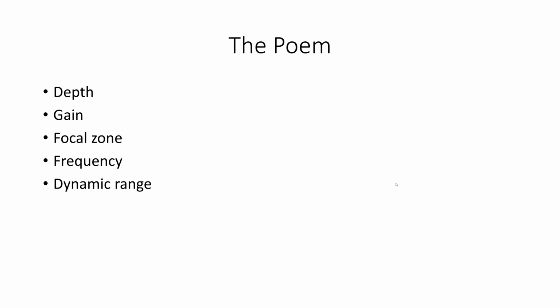Okay. But if you're like me, then the preset is not enough for you. You really are fired up to twiddle the knobs and make the picture look as absolutely fantastic as we can do it. And to make the knobs be the most good and fantastic that they can be, we have to recite the poem. And the poem goes: depth, gain, focal zone, frequency, dynamic range.